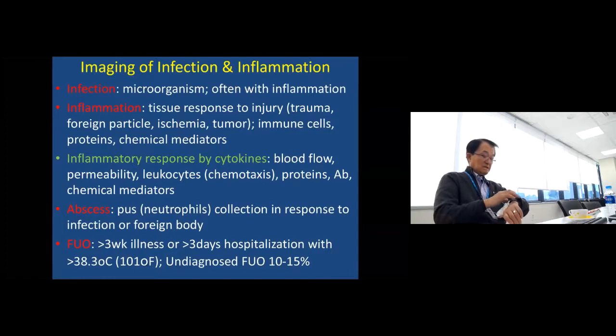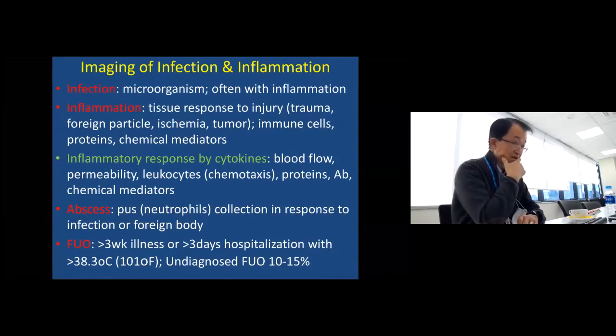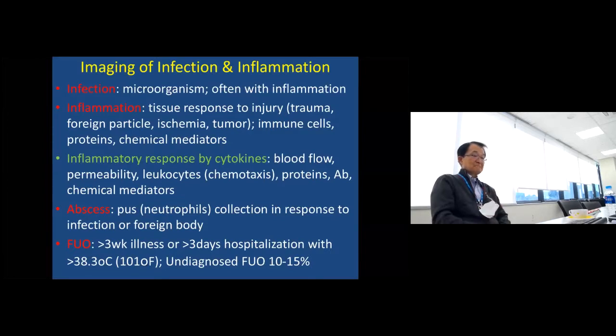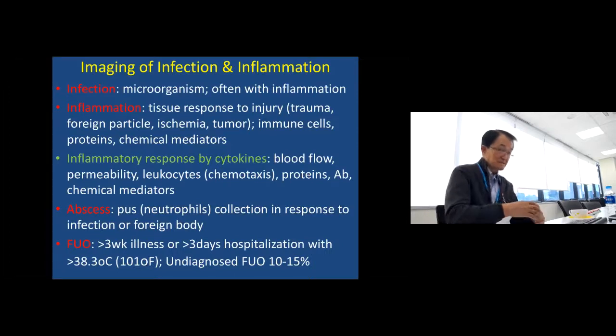Now, the importance of imaging is to look at the whole body and localize certain infectious or inflammatory sources. Then we can estimate the burden of infection by looking at the whole body system. So it's a very helpful but anatomical study, basically showing organized abnormalities like abscesses.